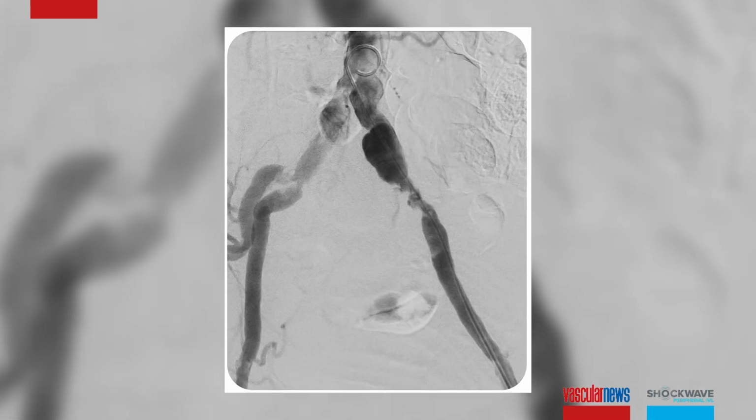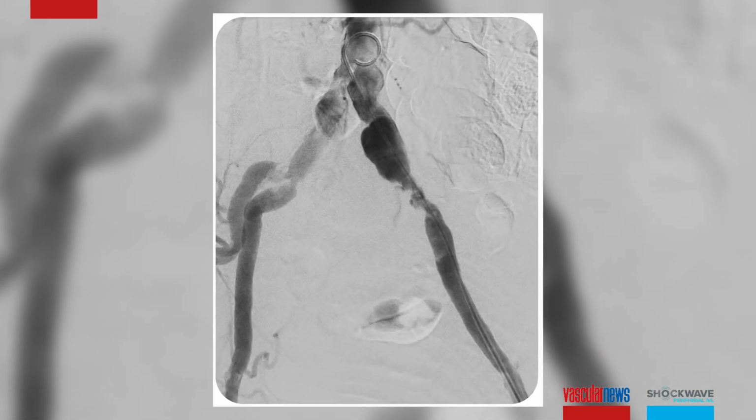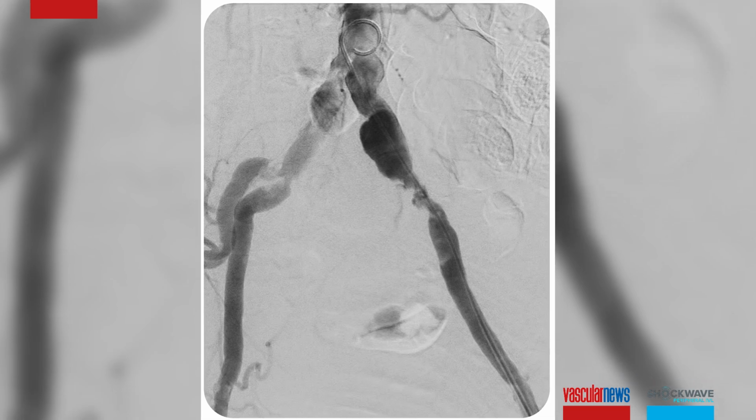So in case of stenting, because the internal was occluded, because of the turbulence, we should have used covered stents, probably two covered stents, or probably an iliac limb with a larger introducer. Of course, in this case, the option to do a good vessel prep and eventually leave nothing behind by using Shockwave L6 could be extremely interesting.